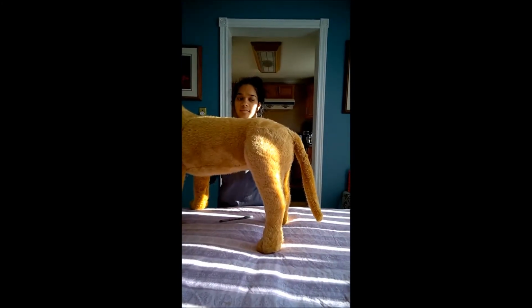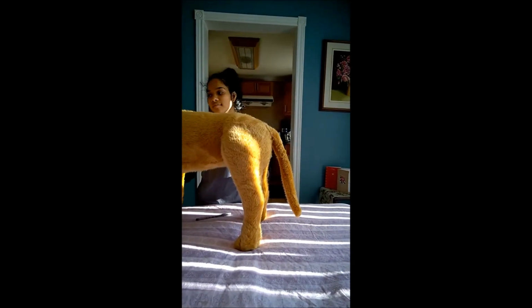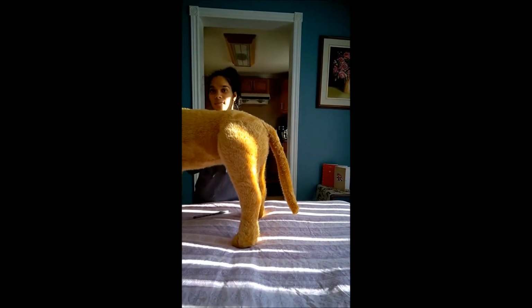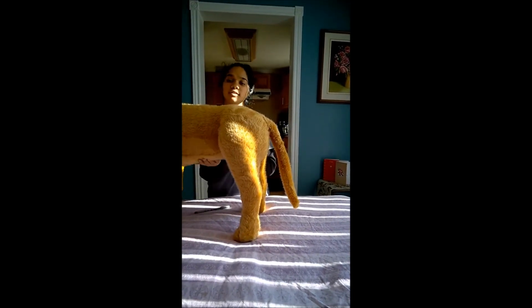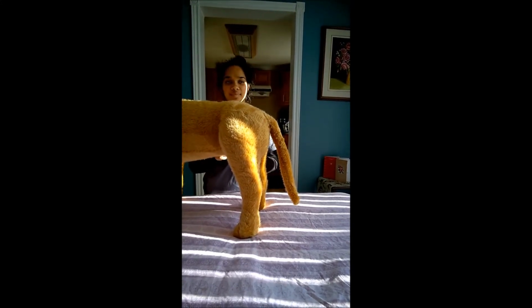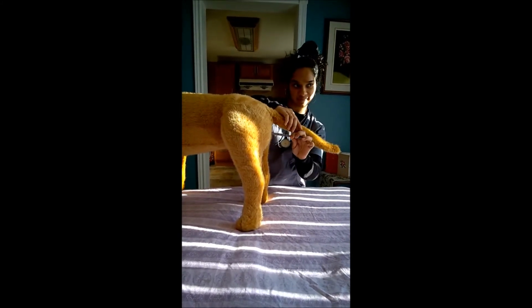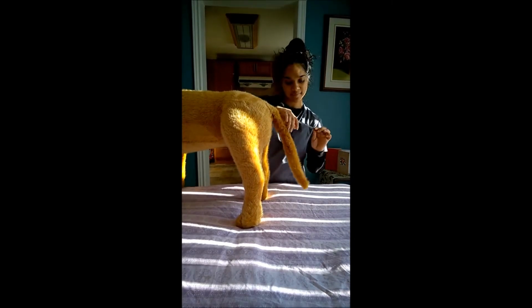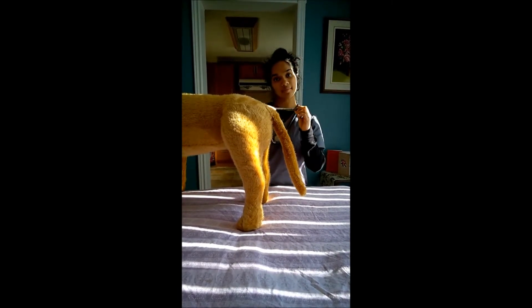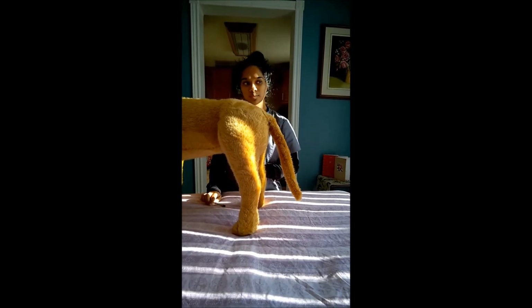Always use a digital thermometer to measure the rectal temperature of your dog. It is more accurate than any other method. First, lubricate the end of the rectal thermometer with either a water-soluble lubricating jelly or a petroleum jelly. Next, insert it into the rectum. Pause for the recommended amount of time by that particular thermometer, remove it, and then view the results. A normal temperature for dogs is between 100.5 and 102.5 degrees Fahrenheit.